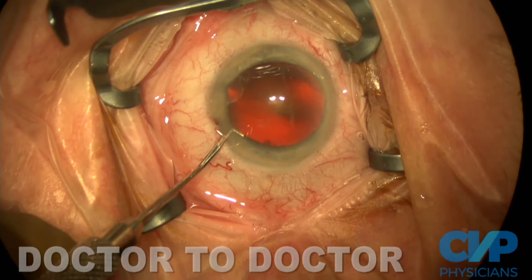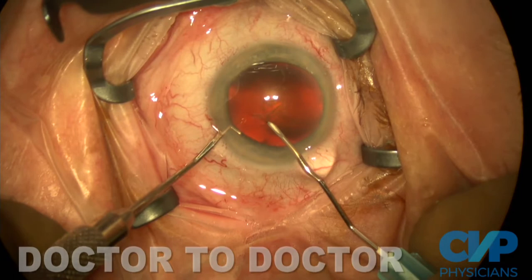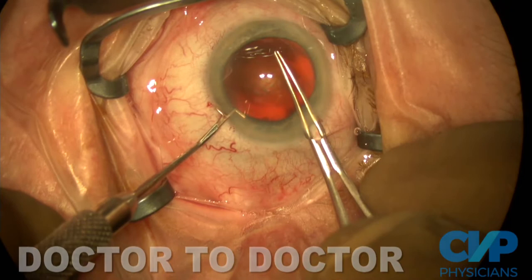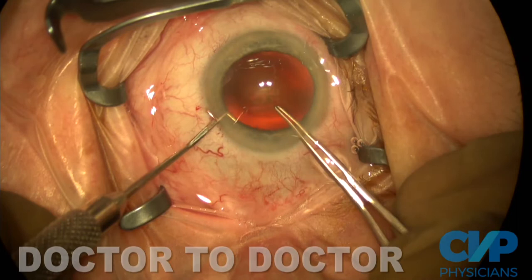A 2.2-millimeter keratome is used to make a triplanar incision at the temporal limbus. I'm finicky about my capsulorhexis — I want them as close to 5.5 millimeters as I can. I use a 6-millimeter capsulorhexis marker for reference, because the optics can make it easy to go too big or too small. I use a cystitome to start my capsulorhexis, then a Utrata forceps to finish. I have a push-pull in the paracentesis — once engaged, I can move the eye left, right, front, and back; since it's topical anesthesia, it keeps the eye from moving during the rhexis.